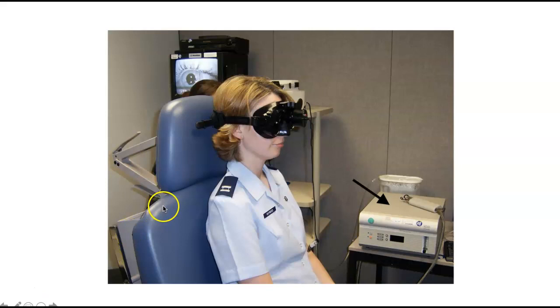Here's another example where you can open and close the goggles. There's a camera in there, which is over here. You can see a nice visual of the eye.